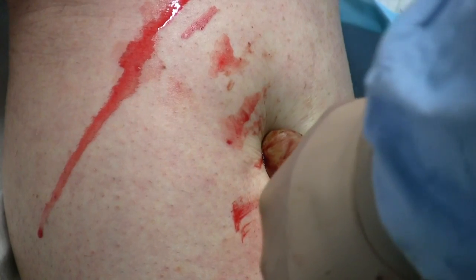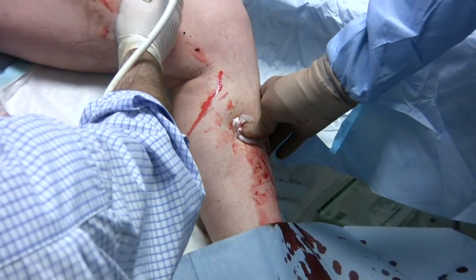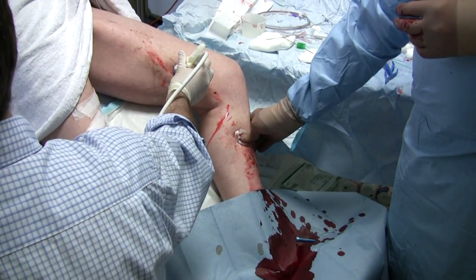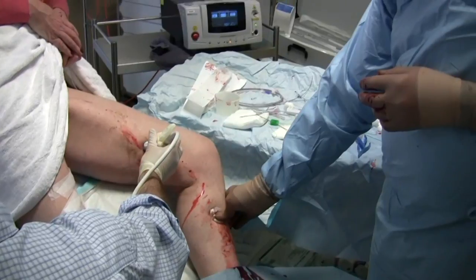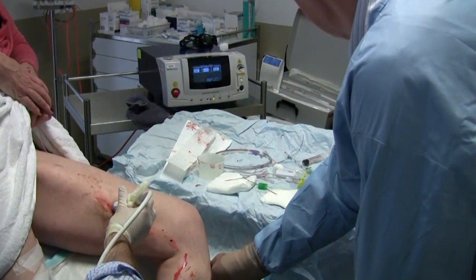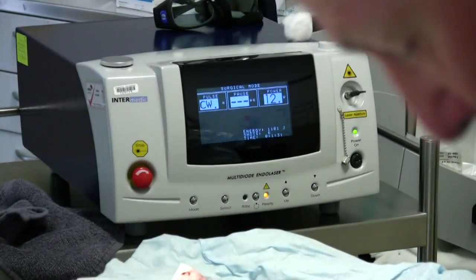Once again, on completion of this procedure, the entry port is sealed with the appropriate dressing. The vein is confirmed to be satisfactorily obliterated under ultrasound. In the background, the laser device can now be deactivated for safety, as the laser ablation component of the procedure has been completed.